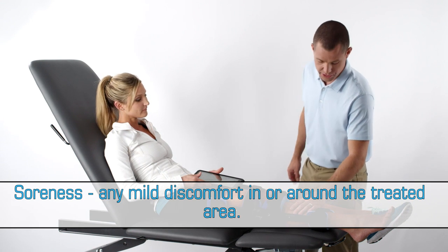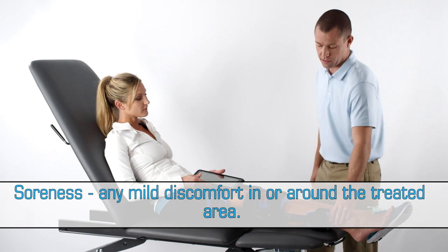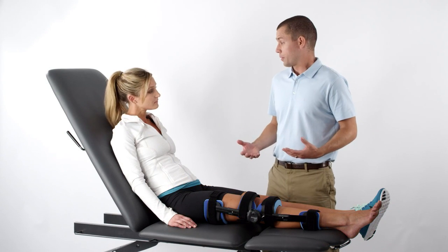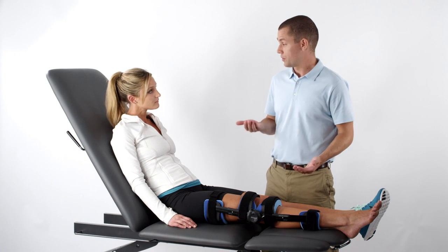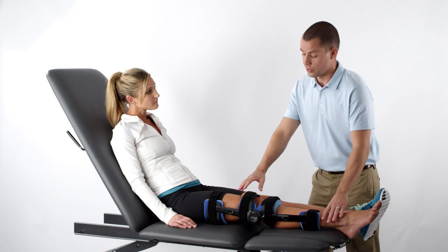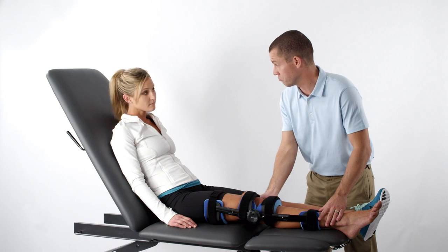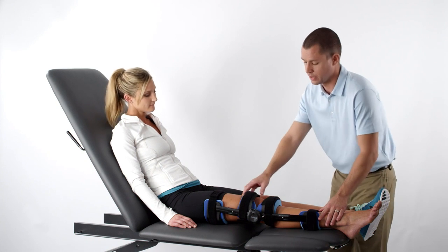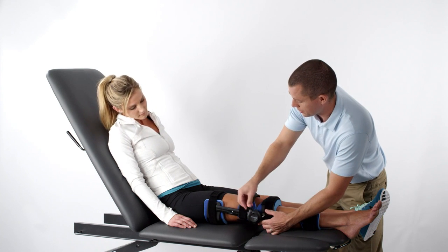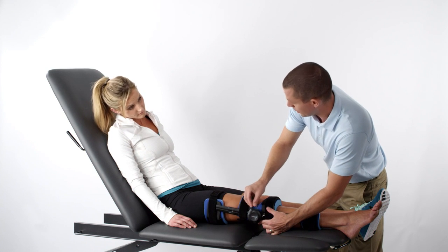The decision to increase wear time should be based on patient tolerance and may be accomplished over a few days or longer if necessary. Once a patient has achieved their wear time goal, a steady increase in tension on the device may be required to achieve range of motion goals. If there is minimal soreness and no range of motion gains have been measured, the tension should probably be increased. Increase the tension gradually, no more than 1 increment per evaluation.